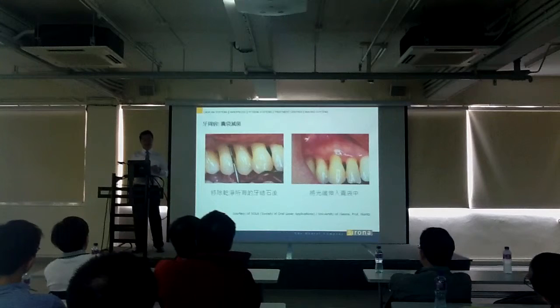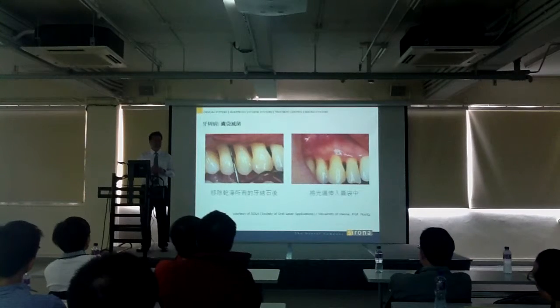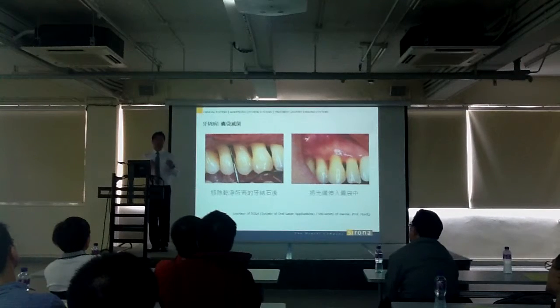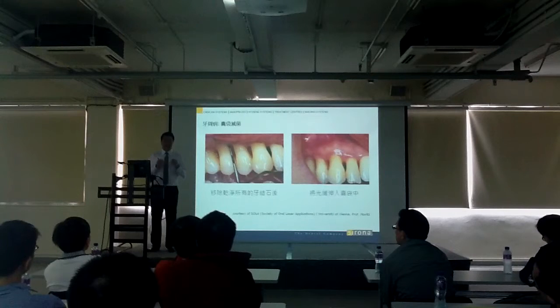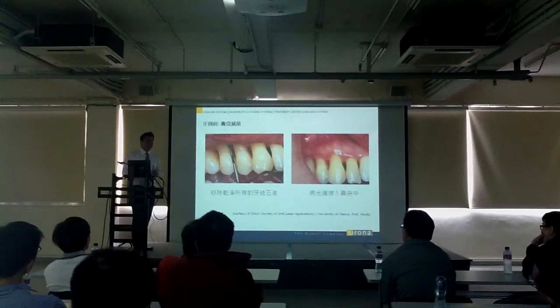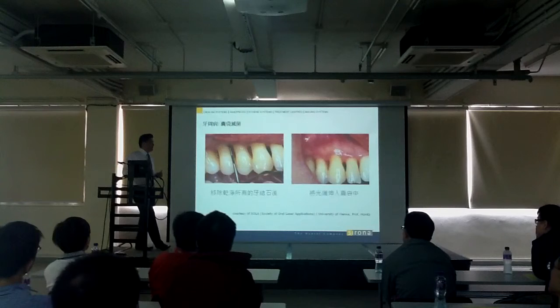How does a diode laser kill bacteria? It's by heating to a point where it shrinks and dies. That's it. Nothing big to it. Erbium YAG works differently. Erbium YAG will give the energy to the water inside of the bacteria, and it explodes. They both kill bacteria, but in different manner. They both cut soft tissue in different manner. So you have to think about what you want to do with the patient. Then you decide which laser system you want.